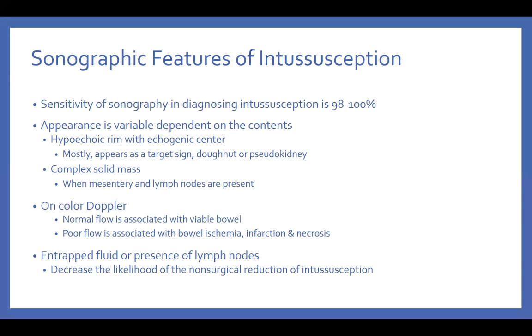In the literature, people say it has a target sign appearance, a donut sign appearance, or a pseudo kidney appearance. That's great. This is exactly what we always say is the typical characteristic appearance of intussusception on ultrasound.